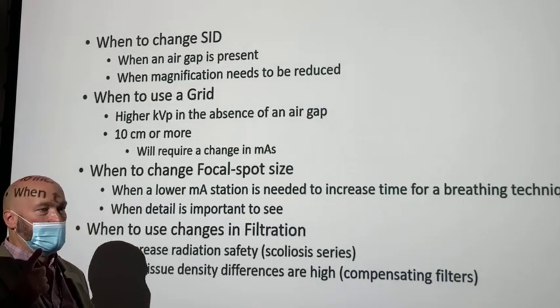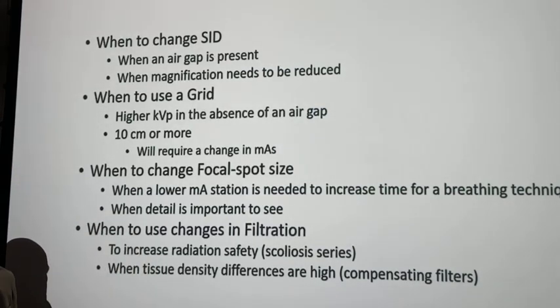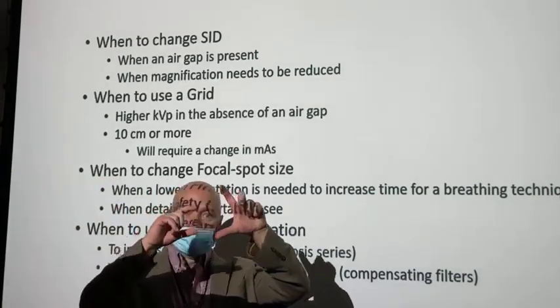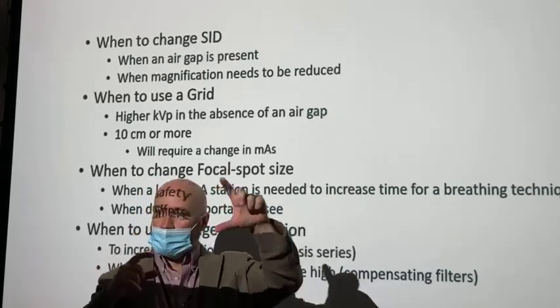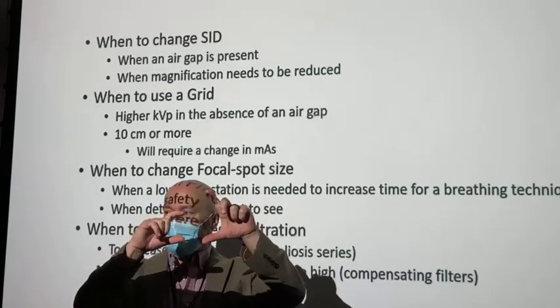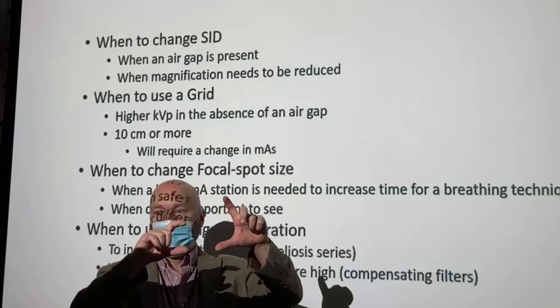So, focal spot size, you should see no difference in your technique whenever you change from large to small focal spot. And this is what you're going to have a tendency to do. It's just a little bit of a leap, but you're going to think, okay, I got a filament this big and a filament this big. Okay, so logically, this big filament can create more electrons than a filament that size, right? And you would be right.